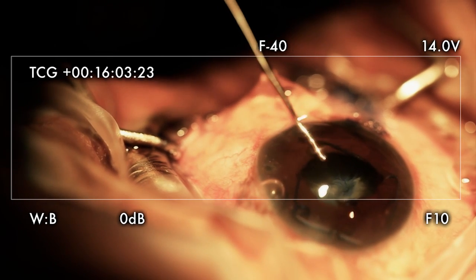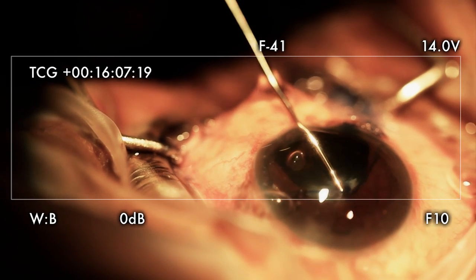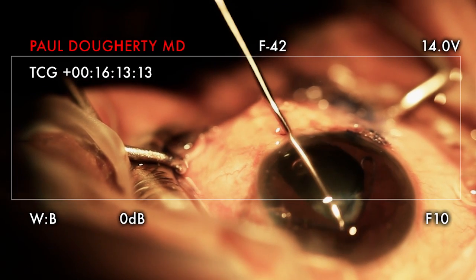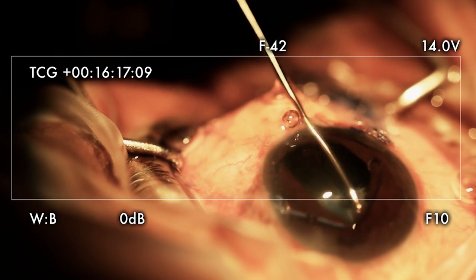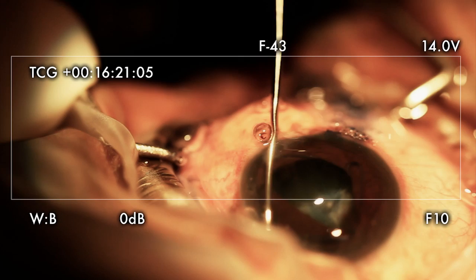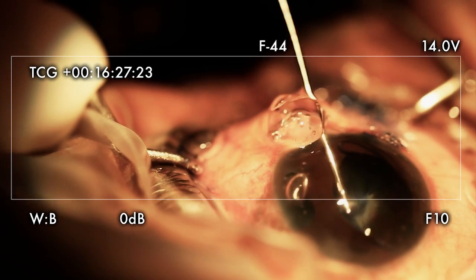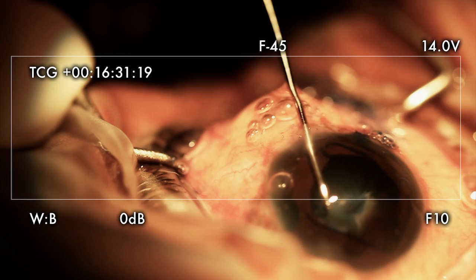She's moaning in pain. She's having a lot of iris pain. Come on, get in there. She's having a lot of iris pain.